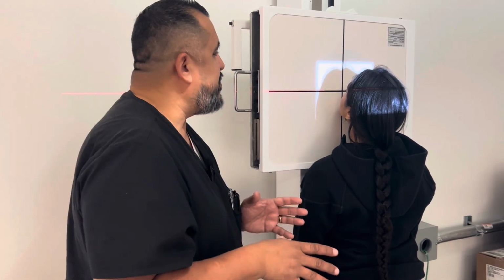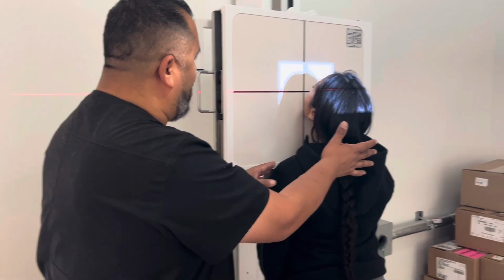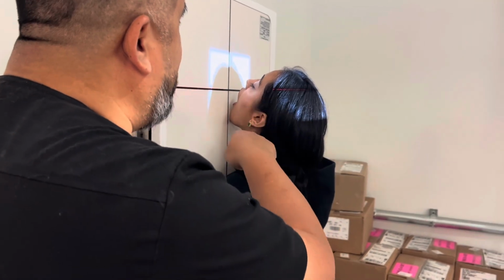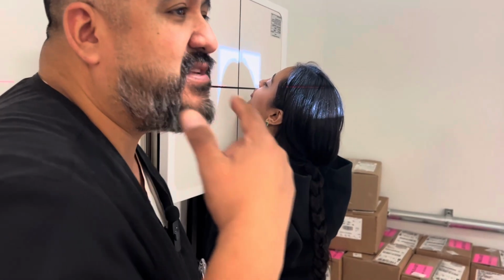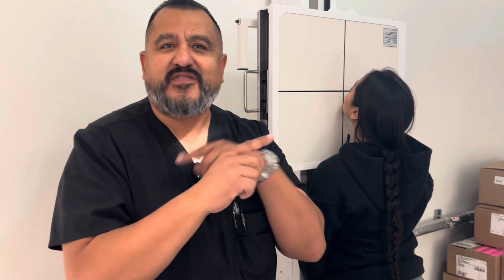Now, a really cool thing, remember, if you do a modified method, you're just changing it up a little bit. So what you're going to do is open the mouth. Just like that. Can you open your mouth there? There you go. So everything stays the same. MML is perpendicular. She just opens her mouth now. You can relax. But this time you're going to see the sphenoid sinuses through the mouth. So if you want to specifically see the sphenoid, you would do a Waters and all you would do is open the mouth. Now, if somebody says to do a reverse Waters, remember, don't make it complicated. You're just flipping the patient over. So don't go crazy.